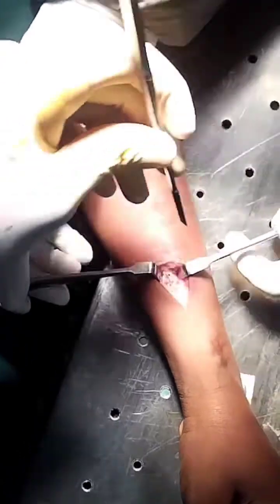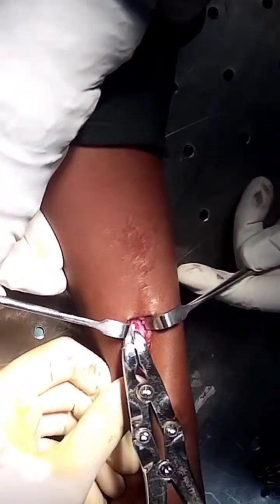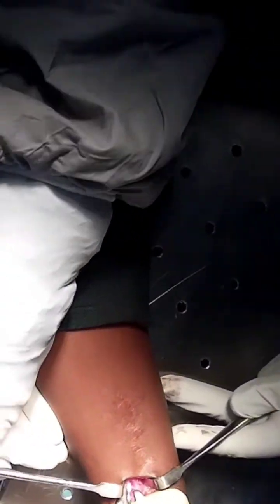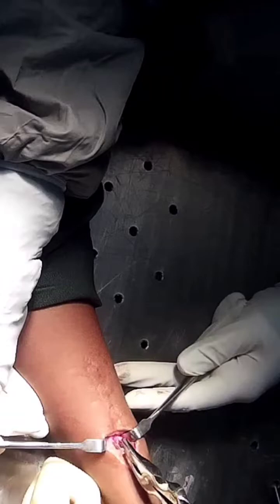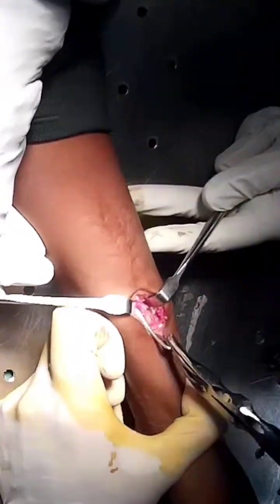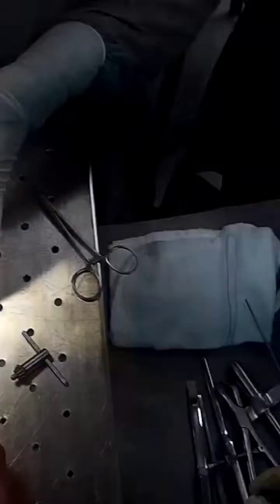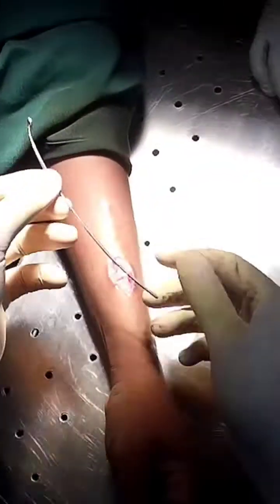Once we are sure that we have adequately removed excess bone around the implant, we are going to hold the tip of the rush pin with the help of a plier. And then first we are going to rotate the rush pin clockwise and counterclockwise, because this is going to break all the bony adhesions around the implant. And then we are gradually going to pull out the rush pin.